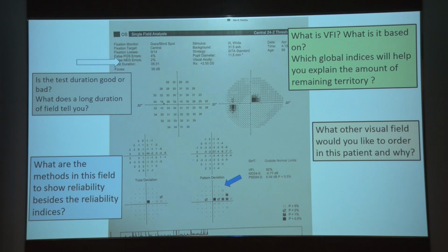Not 16 points. Come down. Go home and check. I will not tell you everything here. Okay? Don't go on the total numbers. In 10-2, how many total points do you have in 10 degrees? At least 10 times higher points than this. All right?